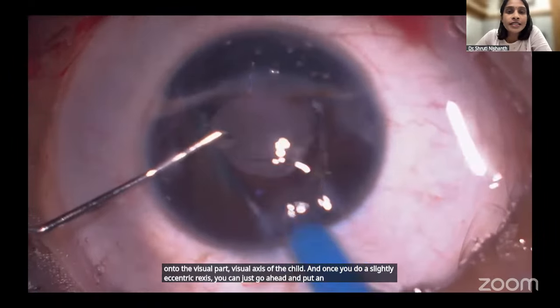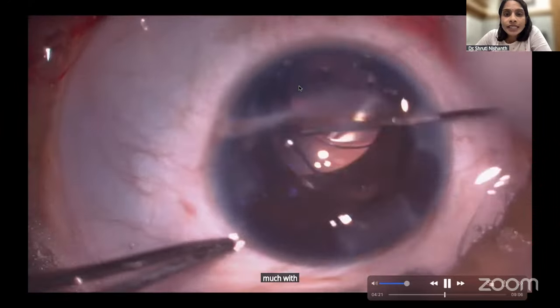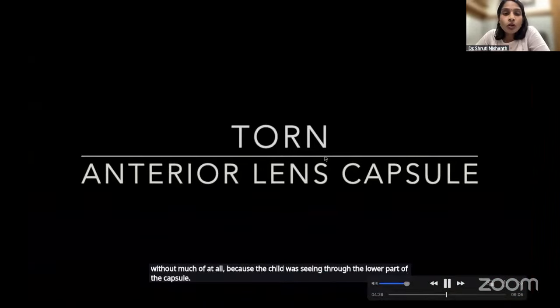There's a large iris defect inferiorly. And because it's large, we hold on to it and do not do much with the pupil as well. Surprisingly, this child did really well, 6/9, without much glare, because the child was seeing through the lower part of the capsule. What about torn lens capsule?